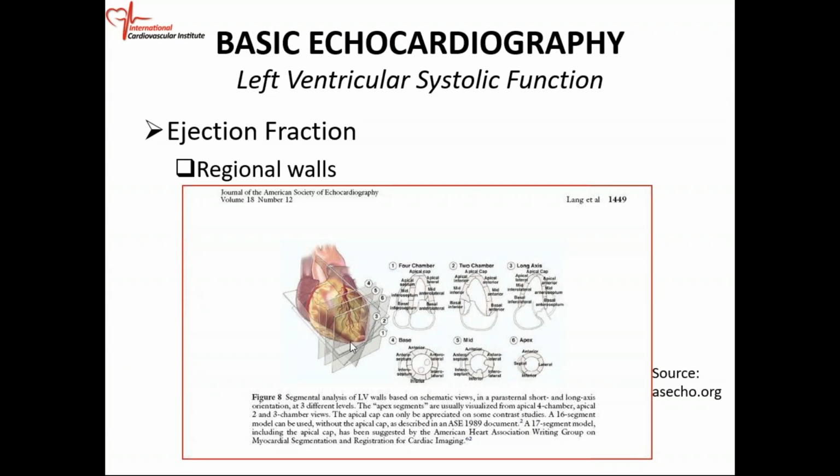If you look, the heart is lying flat on the surface. When we bread loaf it, we can cut from the apex straight to the base, just like we're cutting a loaf of bread. And we can look at the different walls or segments.